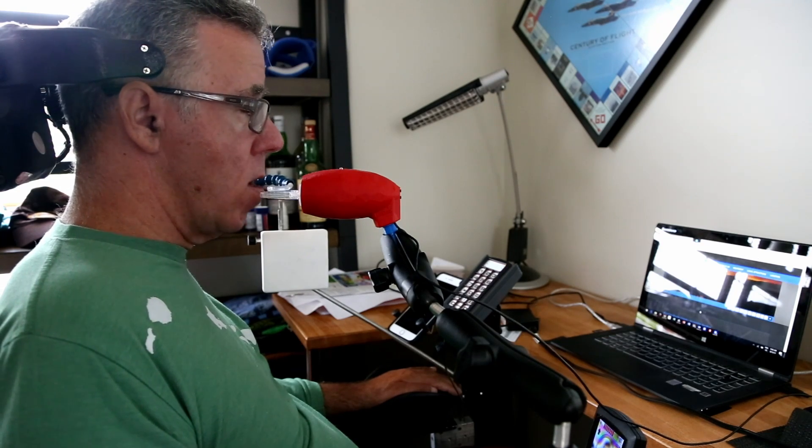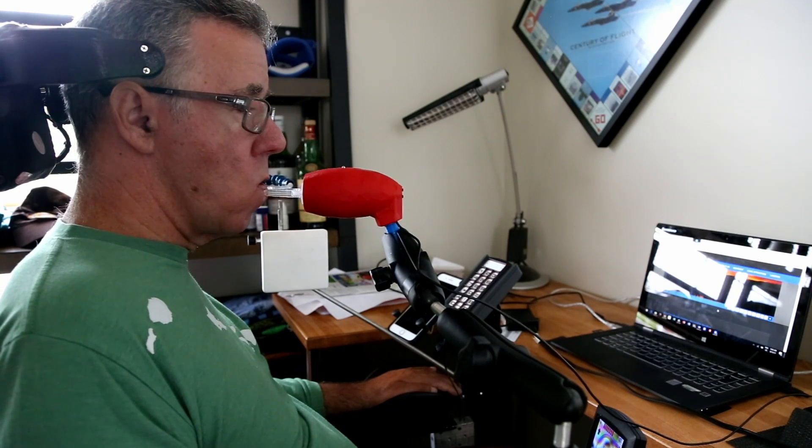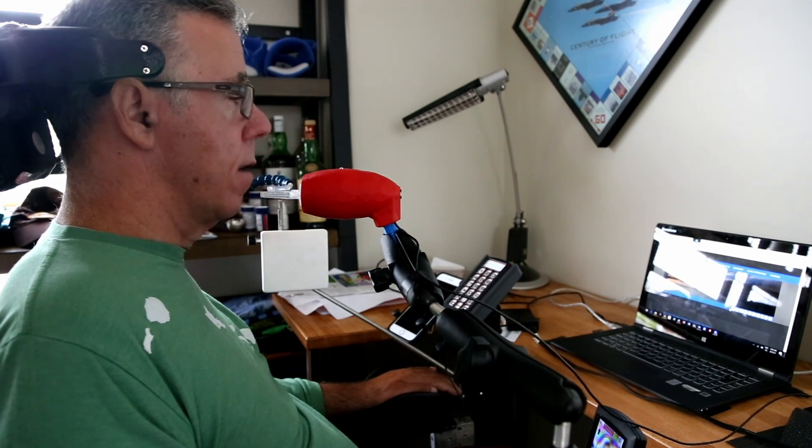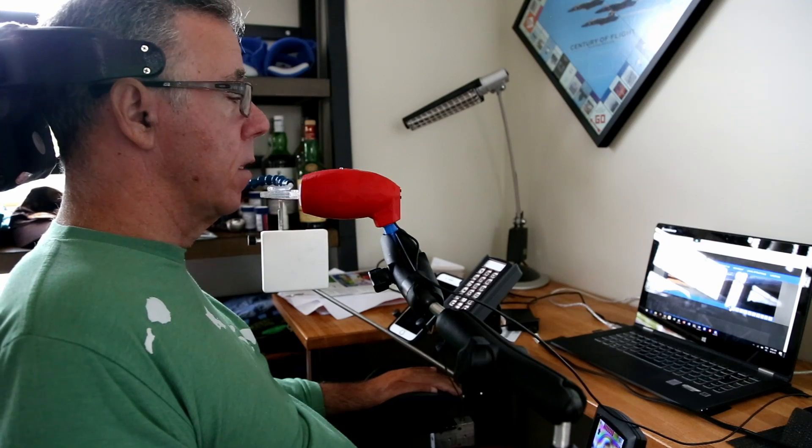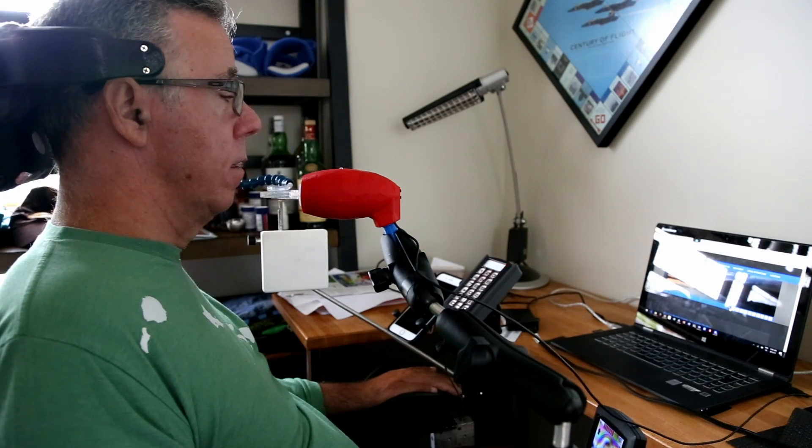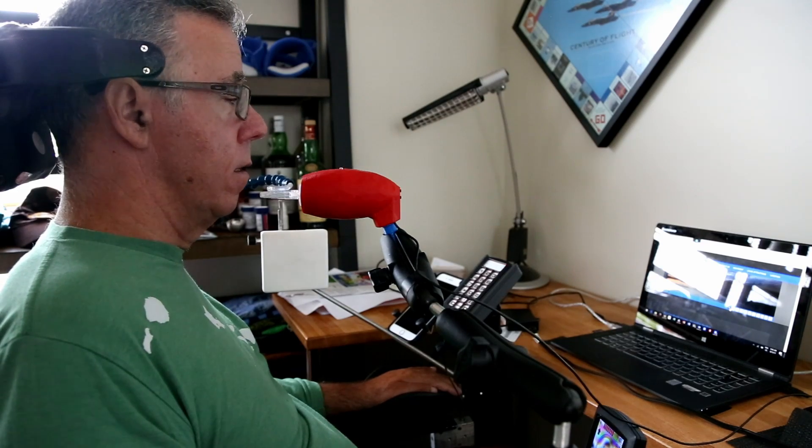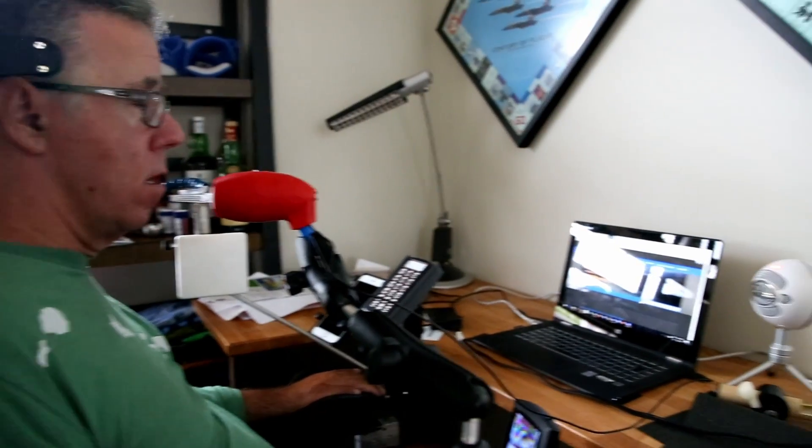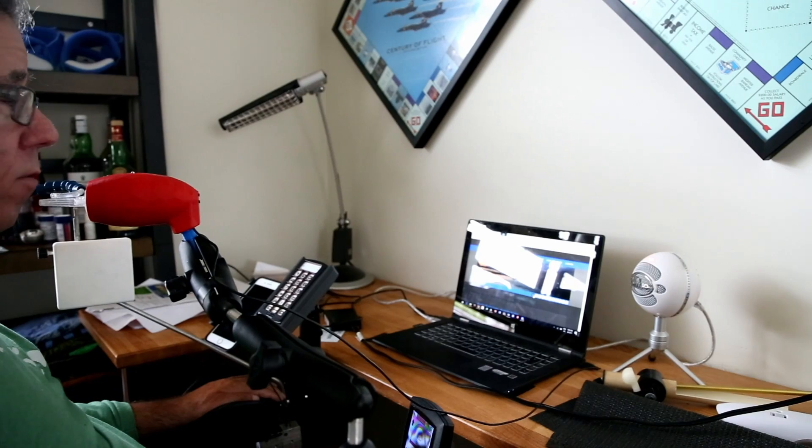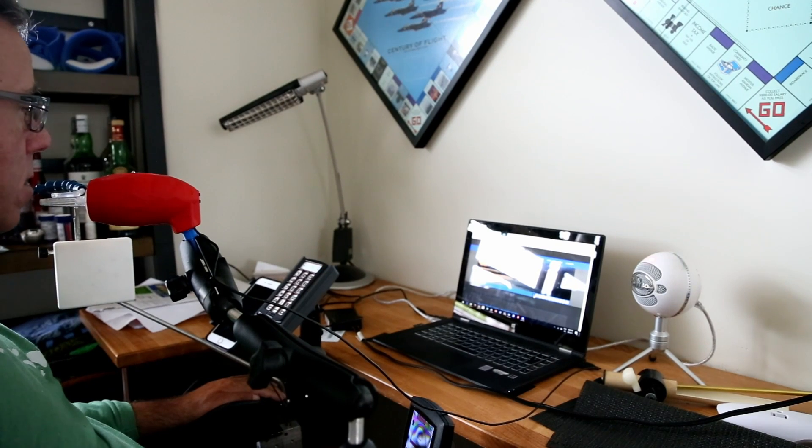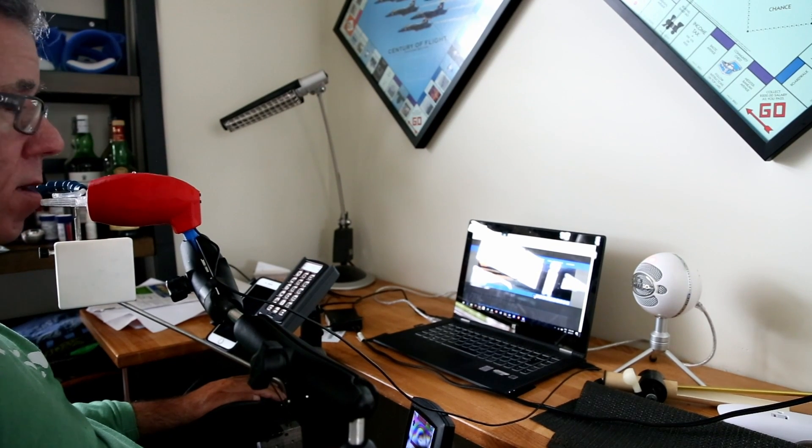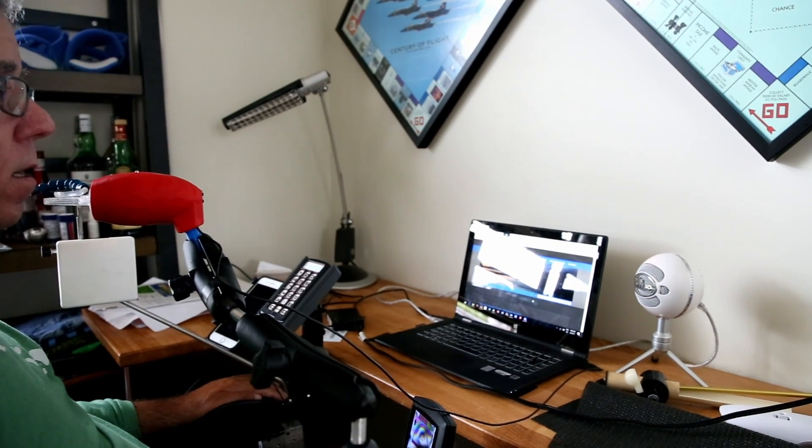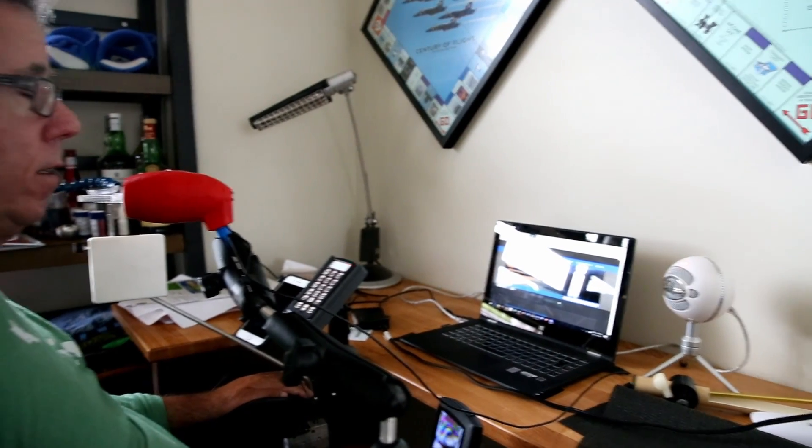You have your computer set up in front of you, and you have like a red joystick looking thing in front of your lips. And you also have a speaker, a microphone, that's the word I'm looking for, to the right there. The Blue Snowball, right? Is that what it's called?